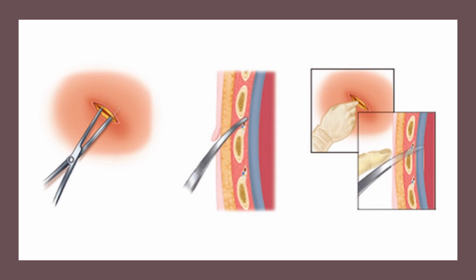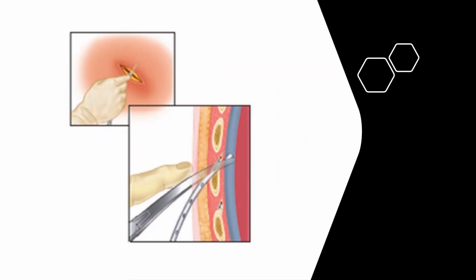8. Open the Kelly clamp while still in, and then withdraw while the clamp is still open to enlarge the dissected tract of entry and allow easier passage of the thoracostomy tube. 9. Explore the dissected tract with a sterile finger to appreciate lung tissue and possible adhesions. 10. To size the tube needed, measure the distance between the skin incision and the apex of the lung. If preferred, place a clamp over the tube at the estimated length.